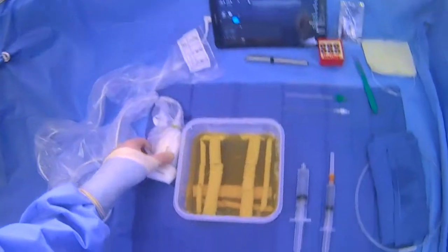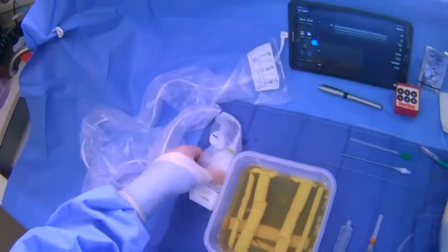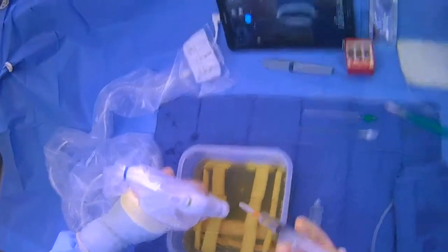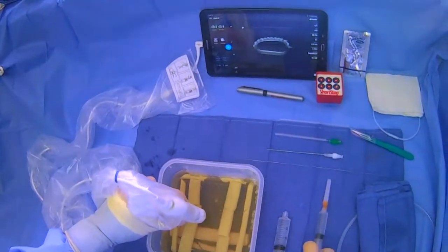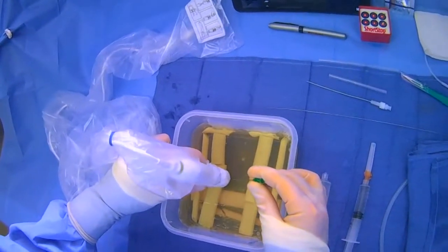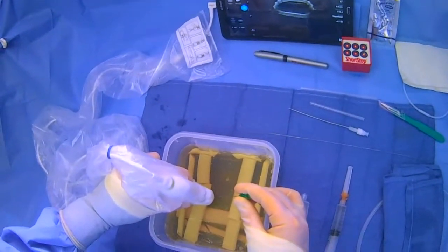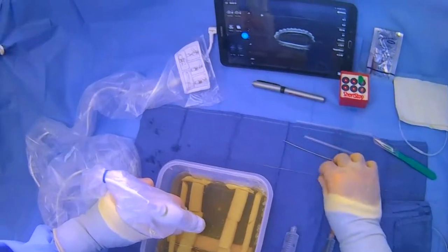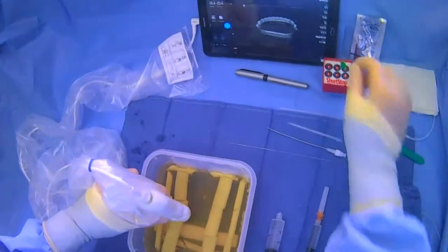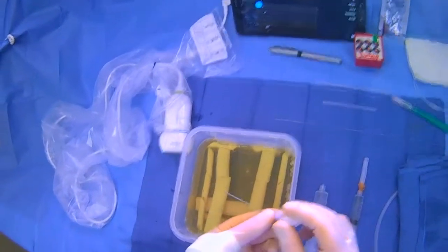Now that subcutaneous numbing has worked, make your dermatotomy at the marked site to ease needle entry. Grab the ultrasound probe and lidocaine again, go through the dermatotomy, and numb up your whole trajectory right outside the vessel. Then set that down, grab your micropuncture needle with the bevel up, and advance until you get blood return — you'll see it on the ultrasound. Once in, put the micro wire in and gain access, making sure it goes smoothly. Take the needle out and discard it in the sharps container, then set down the ultrasound and advance the micro catheter.